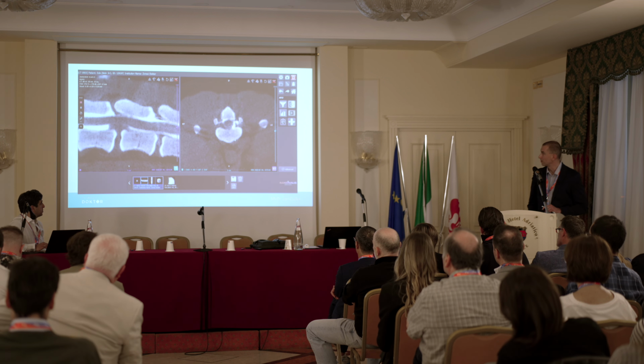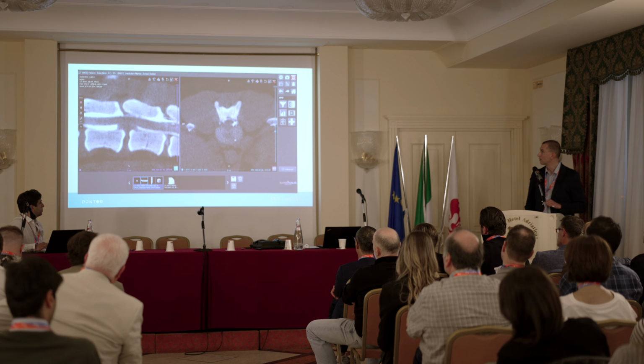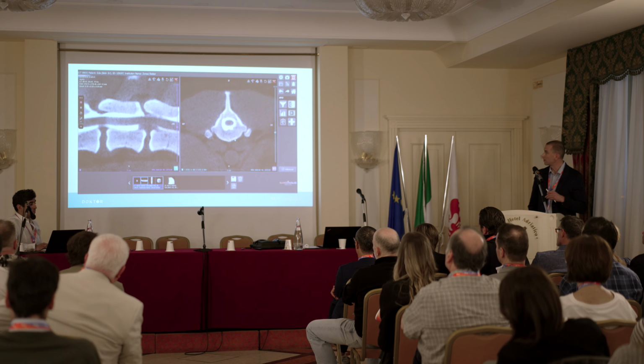You can see how the spine is going upstairs, and there is something in the spine channel, and now the spine is getting back to the bottom of the channel.